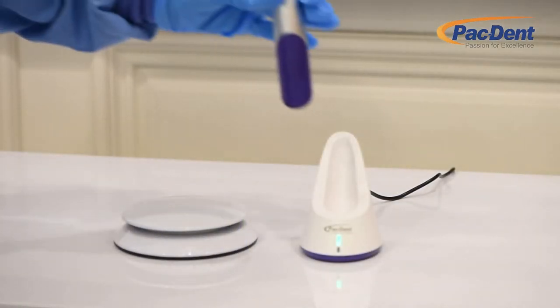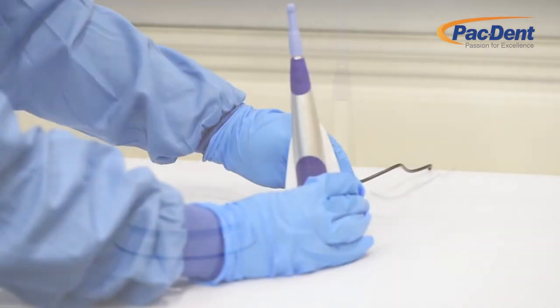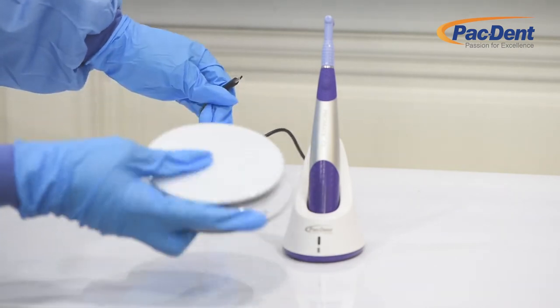To charge the handpiece, place it in the charging base. The LED indicator will illuminate when it's charging. The same cable can be used to charge both the base and the foot pedal.